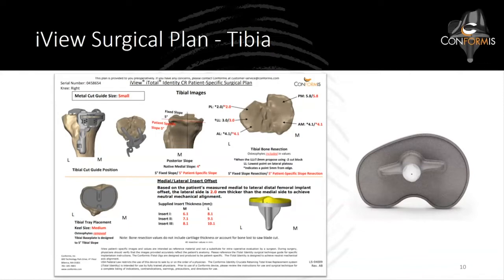The bottom line here is all of the guides that have key cuts on them — the distal femoral cutting guide and the proximal tibia cutting guide — now come with an optional metal cutting guide, which is captured. This has answered a lot of concerns from our surgeons. This is identified on the iTotal. This is a pretty straightforward case. There's nothing about the identity that changes the customized patient-specific components.